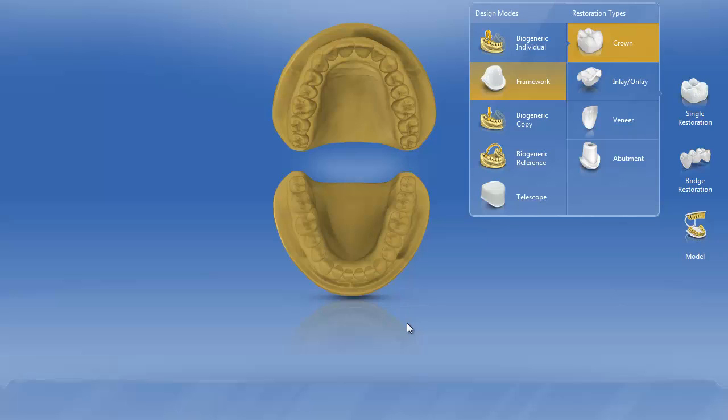In the first video on blocking out dark stump shades, we talked about using the framework mode to create a coping to block out the dark stump shade. The advantage of doing it this way is it's very quick and easy. There's no design whatsoever.